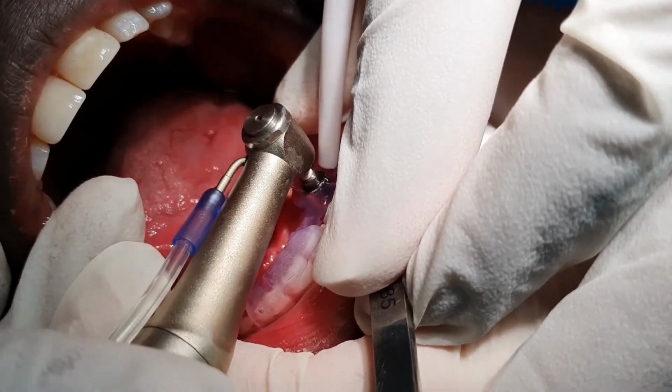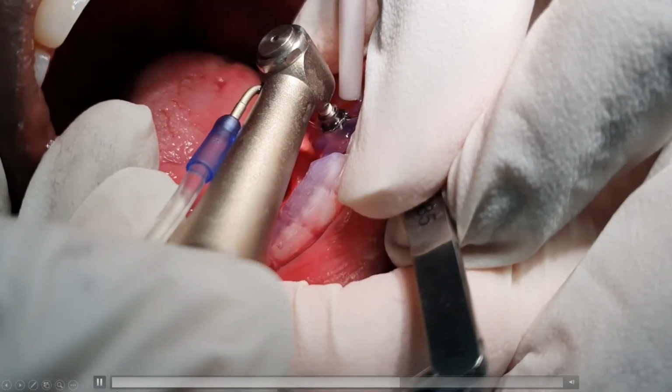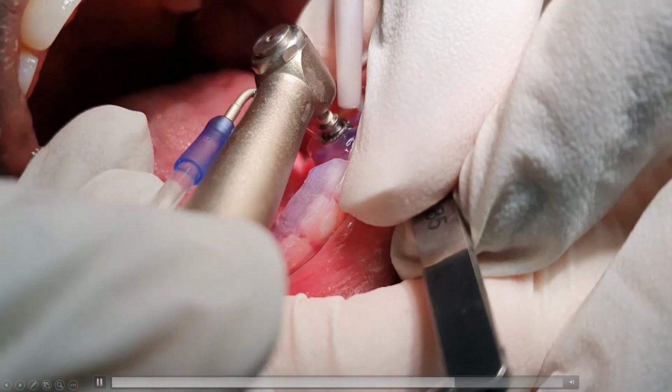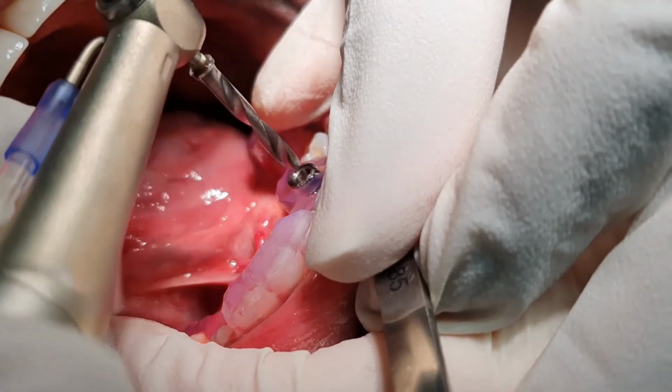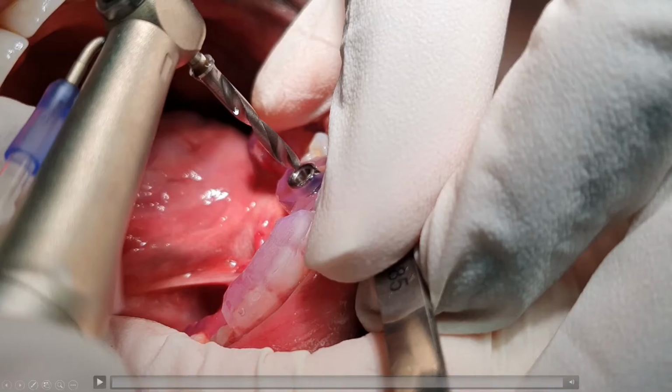And it will get easier, or it should get easier as you go up the increments, because the drill that does the most work, interestingly enough, is the first pilot burr, the 2mm burr. That's having to remove 2 millimeters of bone. This is 2.8, so we're only talking 0.8 of a millimeter of bone more, and that's split into 0.4, 0.4. So really you're only removing 0.4, 0.4 from either side. So a lot less work is being done by the larger drill, and of course the centre part of the drill probably remains very sharp because it never has to do any work.